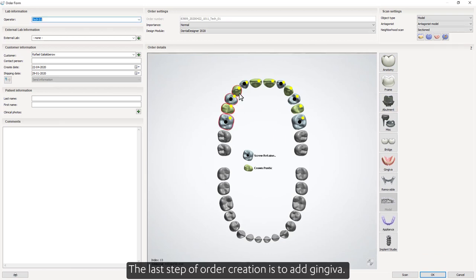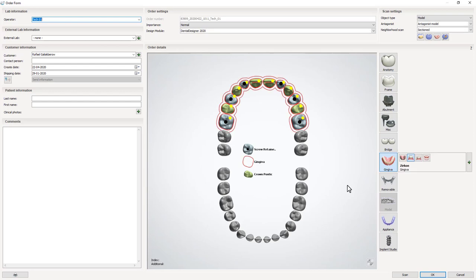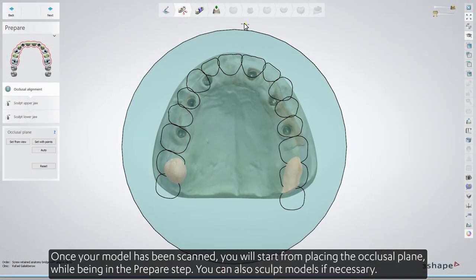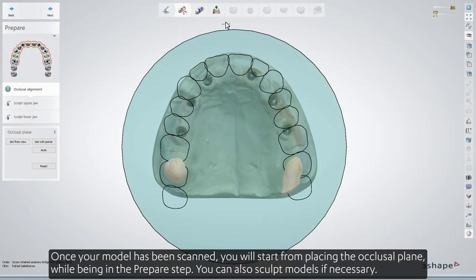Also remember to select the material of your choice. The last step of the order creation is to add gingiva. Once your model has been scanned, you'll start by placing the occlusal plane while being in the Prepare step.